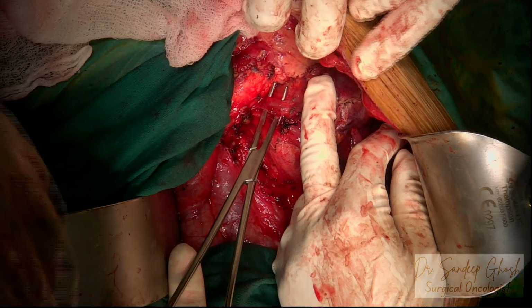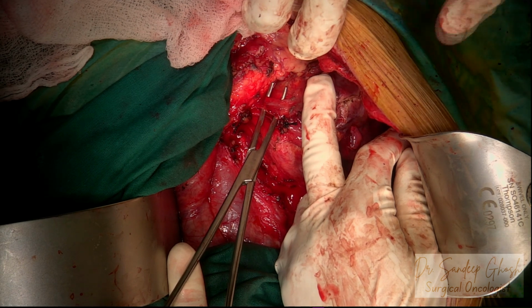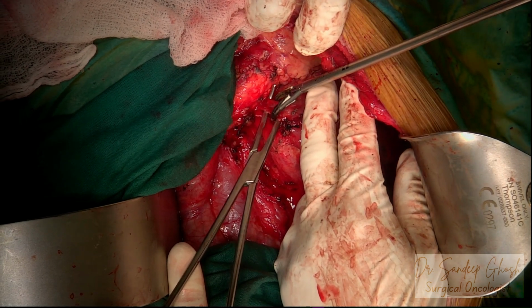Now that's the pancreas above. Yes, the pancreas above and the paraaortic mass below. So we'll have to separate it from the pancreas. That's what we are doing here.